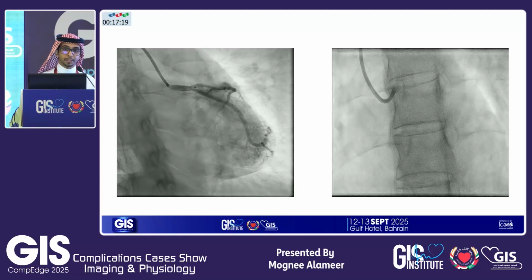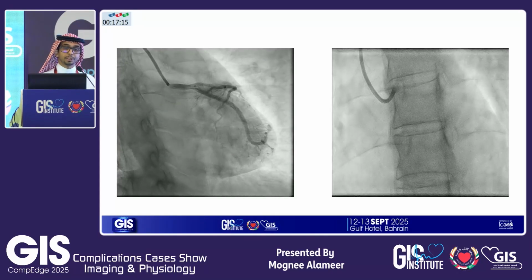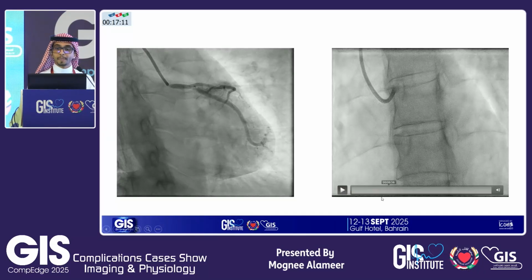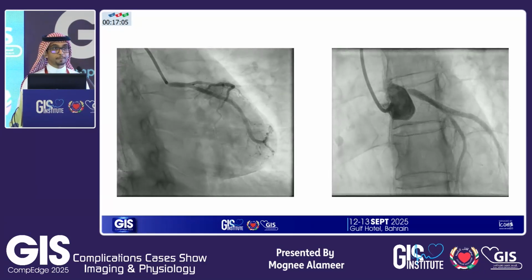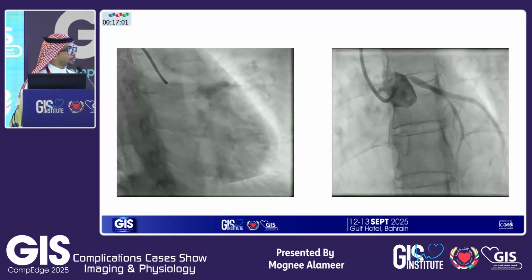And we see it's a real lesion maybe. There at the ostium, you can see the haziness. There was a damping. There is no backflow. I actually did a cranial non-selective after I gave 600 of nitroglycerin. And we can see that the ostial left main is not normal.